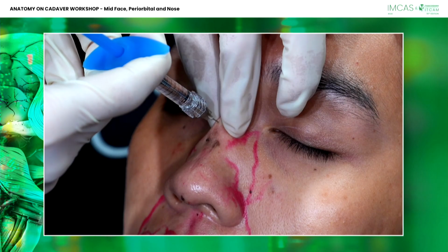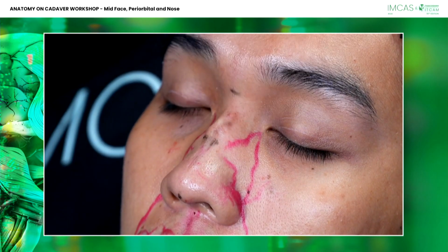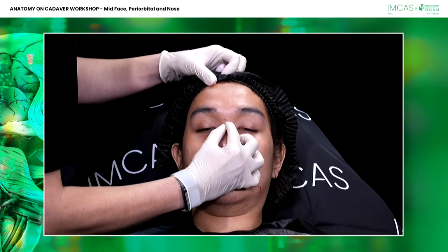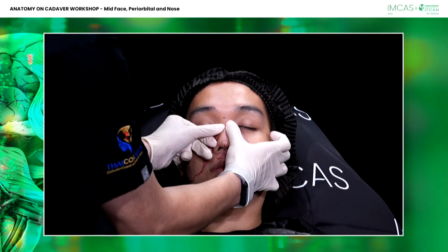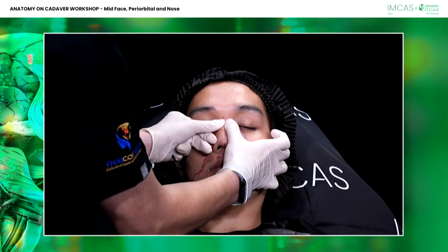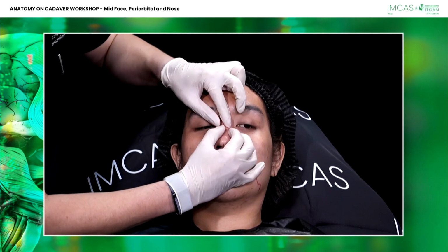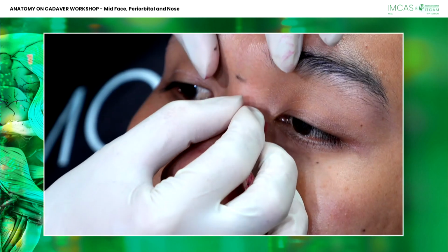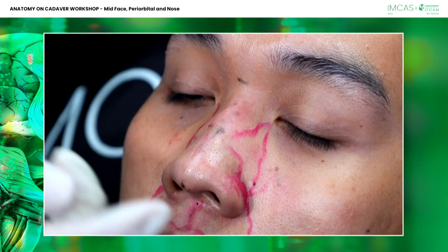So now the 0.1 demonstration here. Every doctor knows we should keep 10 seconds. It's very important. No need to hurry for this area. And after that, it's just molding, and you're going to see a little bit higher of the nose area now here. In front, you can see a little bit higher.